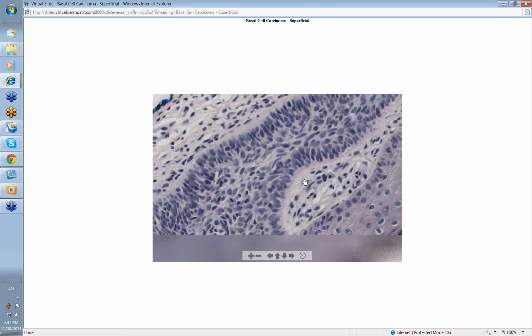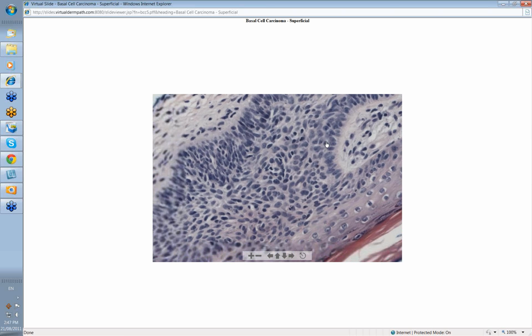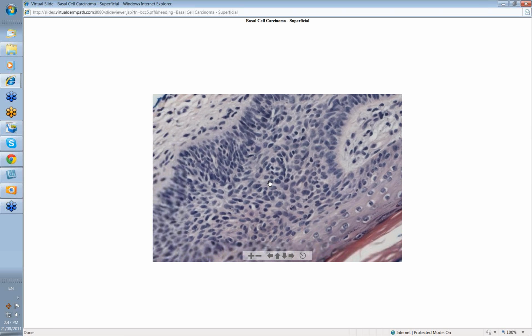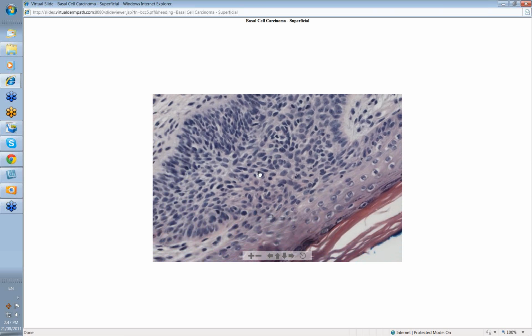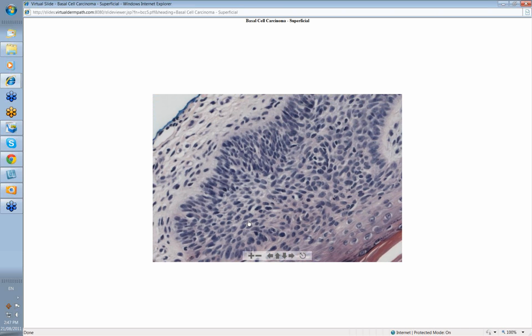You sometimes can see mitoses in these, and you might think, well, if there are mitotic figures, that means it's a fairly rapidly growing proliferative lesion. But there's also a fair bit of what's called apoptosis, or programmed cell death in these. So in spite of the proliferative activity of these, a lot of the cells are in fact dying off as well. And it's one of the features that means that these lesions don't in fact go very deep.